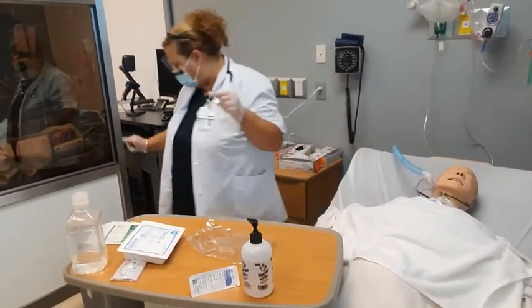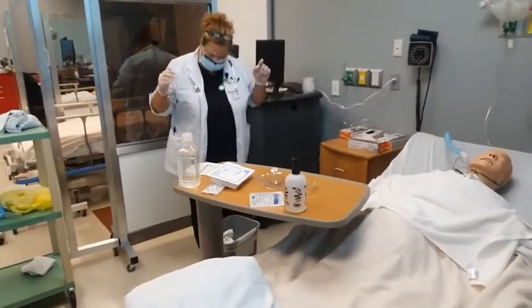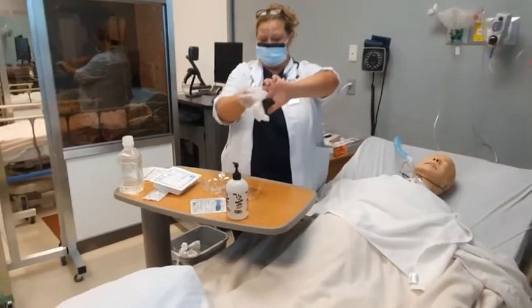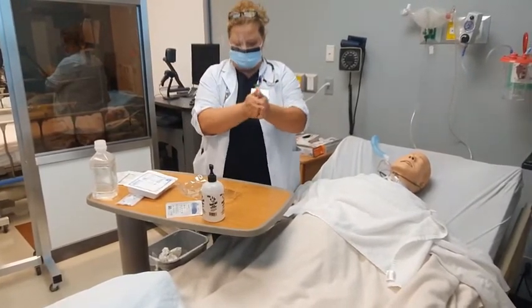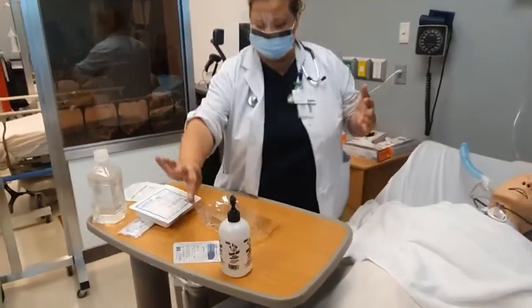Remove gloves and cleanse hands. Move the garbage can closer to you over here by your table to make it easier, okay? So then I'm going to remove the gloves. I'm going to cleanse my hands. Then open your disposable inner cannula package, but do not remove the inner cannula.